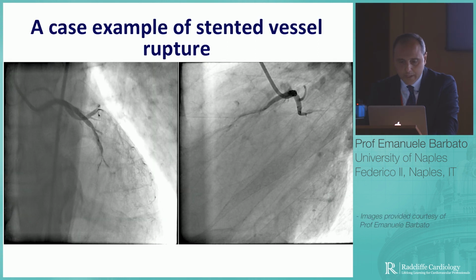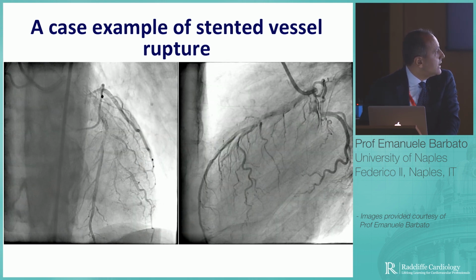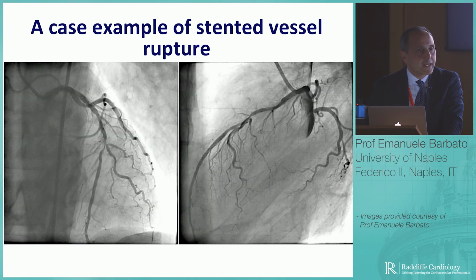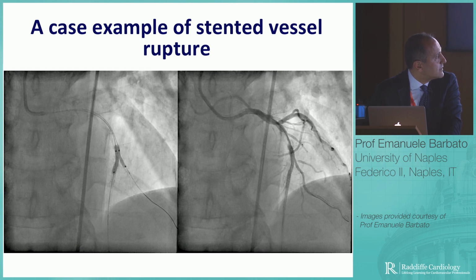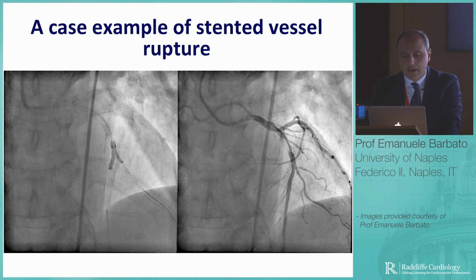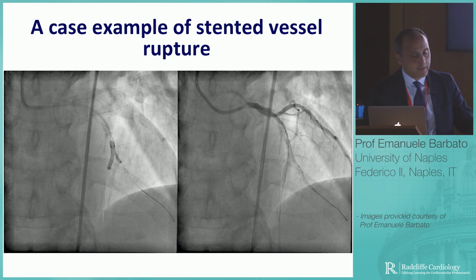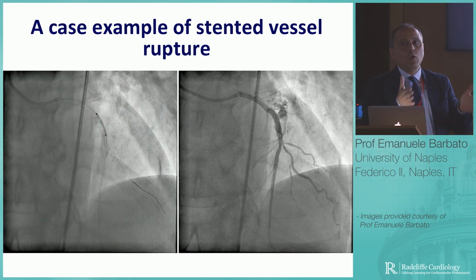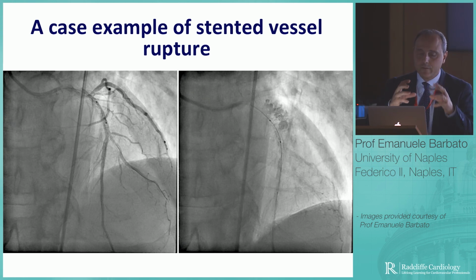And I just want to share with you one of the cases that I borrowed from one of my partners from Aalst. In this case, angiography shows us that there is some calcium, but this is a kind of patient we would treat with regular balloon dilatation, and that was the case. Even stents were implanted at the level of the bifurcation there with no plaque preparation at the proximal lesion. Of course, the colleague was overconfident that he would manage like he did for the distal part of the lesion. And as a matter of fact, he was partially right. He managed to implant the stent, but in an attempt to optimize the stent, to fully expand the stent, he got this perforation. So those problems can still occur even if we have a stent already in place.